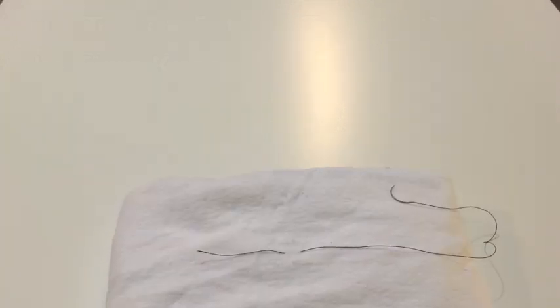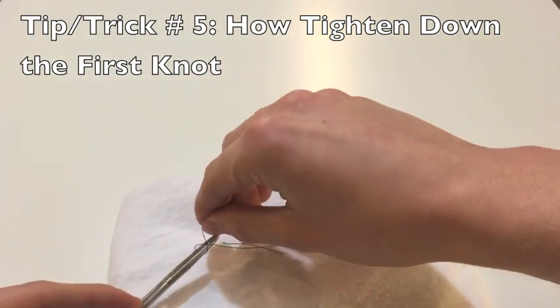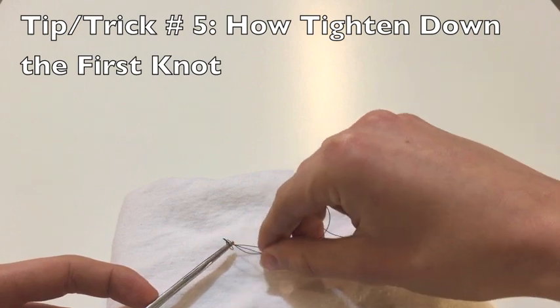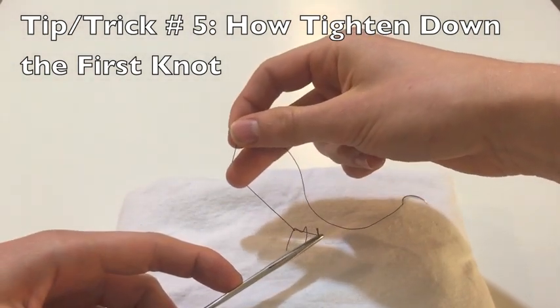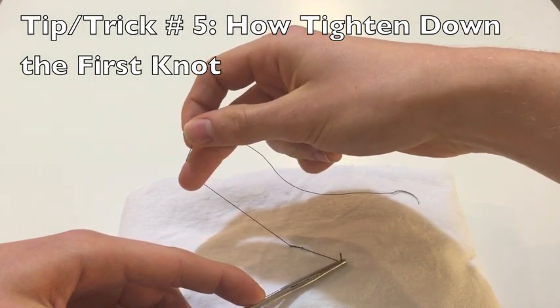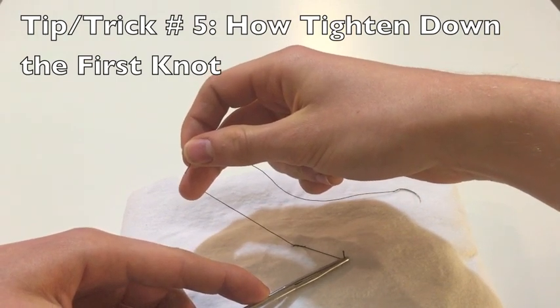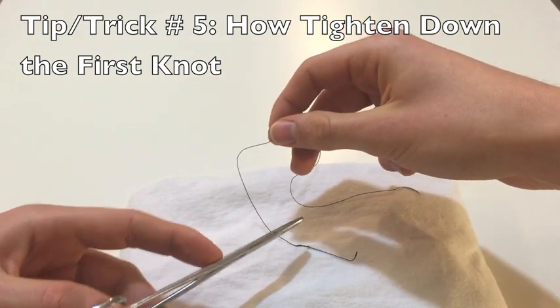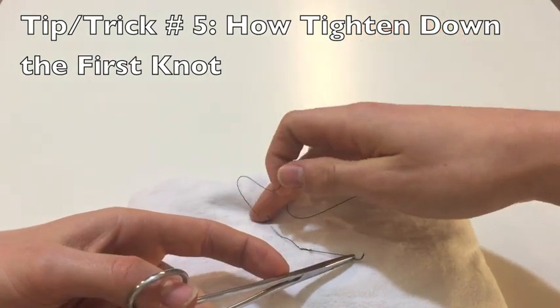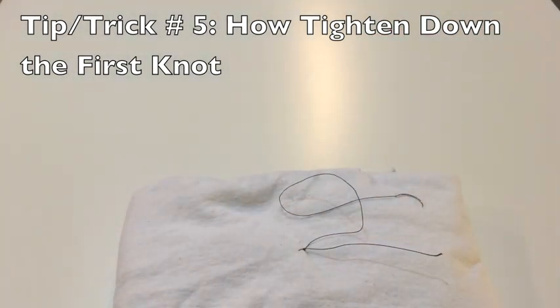My fifth tip requires that I undo that first surgeon's knot and throw it one more time. Here I make the surgeon's knot by wrapping my suture around my instrument and grabbing the far end of the free end. As I tighten down this first knot — and this is only important on the first knot — I'm making sure to really tighten down by pulling my needle side away from the knot and keeping my free end on my instrument close to the knot. This makes sure that I preserve that short length we created at the beginning. That's my fifth tip: how to ensure you keep your free end short on your first throw.